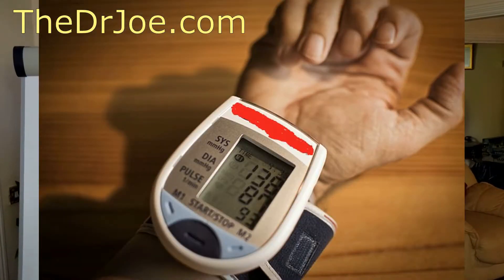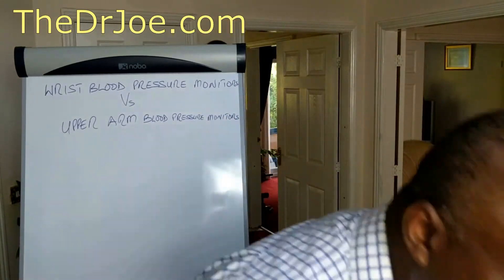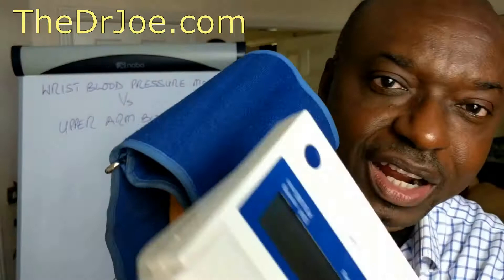Wrist blood pressure monitors have grown in popularity. Everybody seems to be buying them and using them to monitor their blood pressure at home. That's not a bad thing, but I'm really concerned about what those wrist blood pressure monitors are delivering compared to the upper arm monitors.